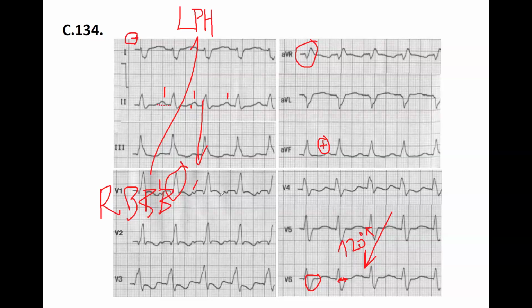And just quickly, for the left bundle branch block, what I wrote down, I don't know if I quoted that correctly, is that it's a left bundle branch block if we have a supraventricular rhythm plus an intraventricular abnormality. Would that be the explanation enough? If we just see a supraventricular rhythm, because of an AFib or something, and we see long, wide QRS complexes, yes, that's enough.